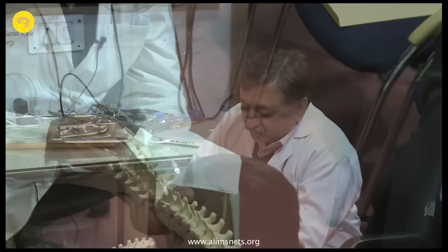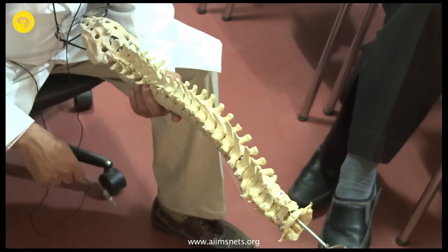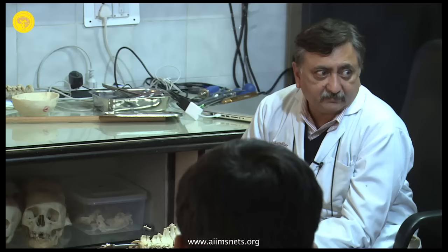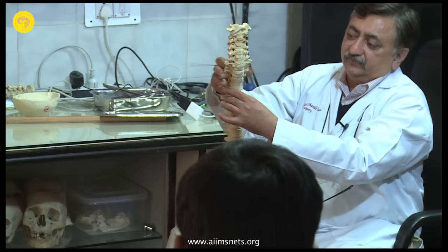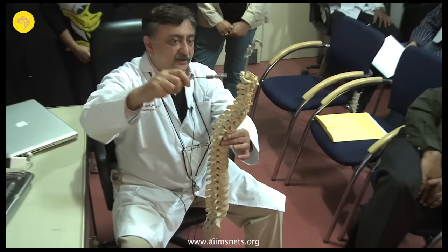So for all practical purposes, I would ask you to forget about cervical pedicle screws. You should do it only when you have gained a little more experience than now. Because in the cervical spine, using a lateral mass screw works very well. Why is the loading of the spine important? On the cervical spine, the loading is only of the head and the neck. All other structures get attached lower down.